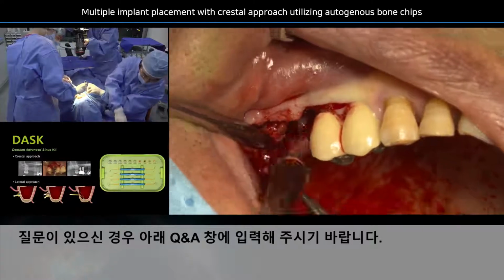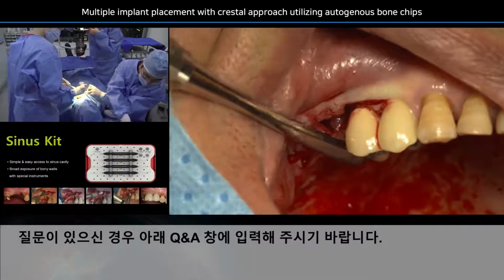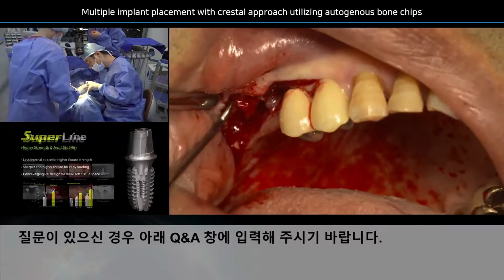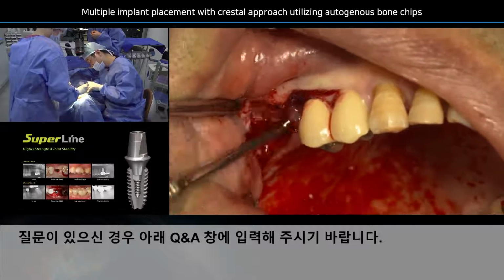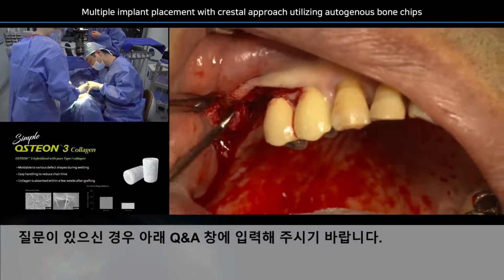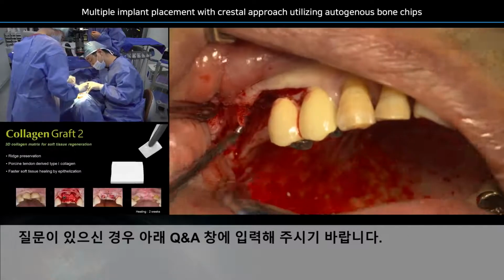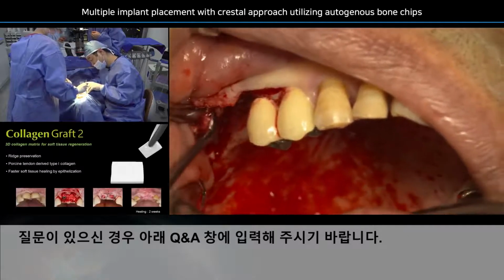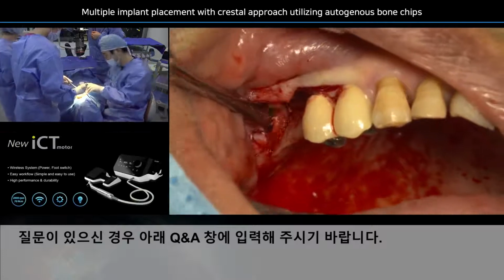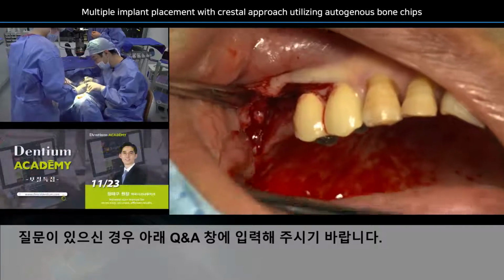Now there you go. And then by pushing actions, I think I will use the Molt curette. By push motion, I can go over the bone, as you can see here. I can go over the bone and detach and remove the soft tissues here. Especially at the tooth area 16 and 17, there's a huge amount of granulation tissue, right? So I think I'm going to use some tools like this one, or a hemostat, which usually sometimes works. Okay, there we go.